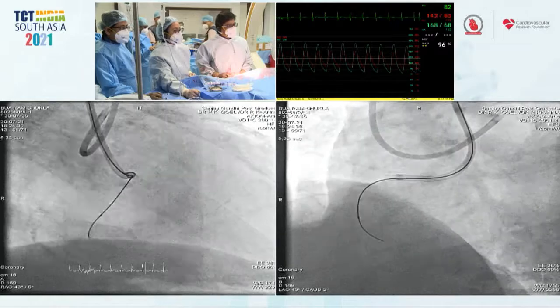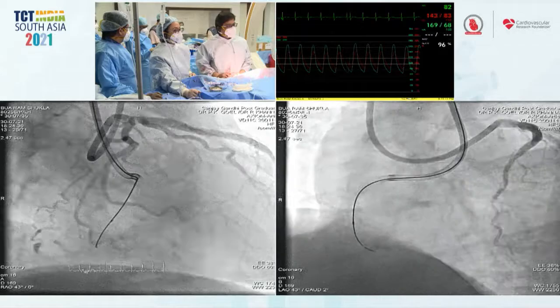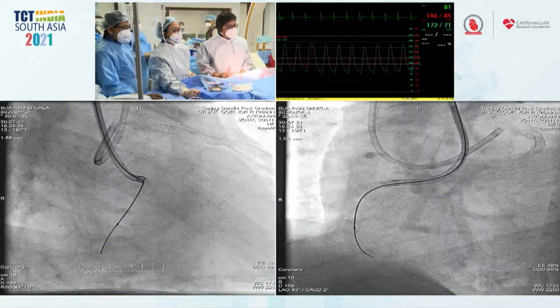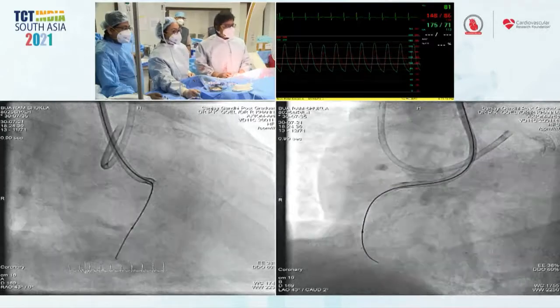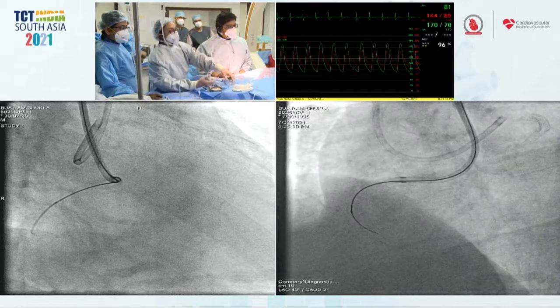Yeah. There's a couple of reasons. One, you're on top of the artery, so that's very favorable for you. I would try to get onto the flat part of the artery, and then bring a Stingray, and really try to sort of puncture into this with ADR next before I go retrograde. You have all your options on the table. Yeah. I think I'll try ADR first.